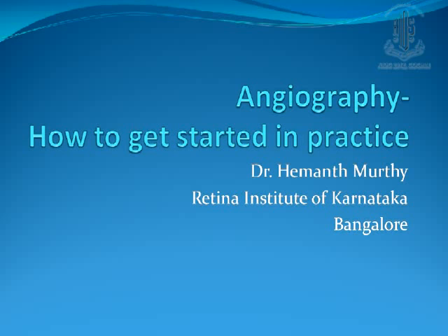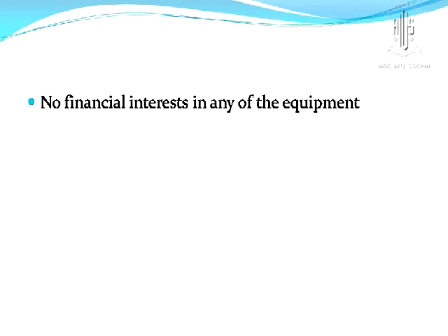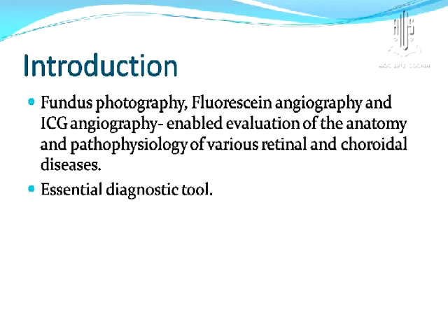I'd be covering angiography, how to get started in practice. I have another session also. I have no financial interest in any of the equipment. Fundus photography, fluorescein angiography and ICG angiography have enabled us to evaluate the anatomy and pathophysiology of various retinal and choroidal diseases, and are an essential diagnostic tool.